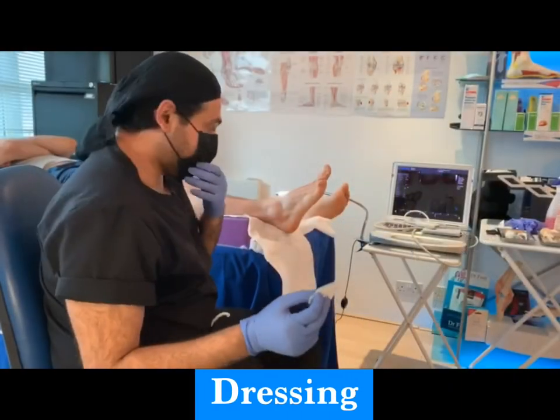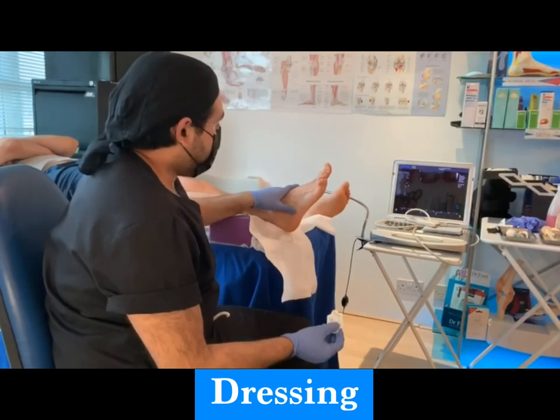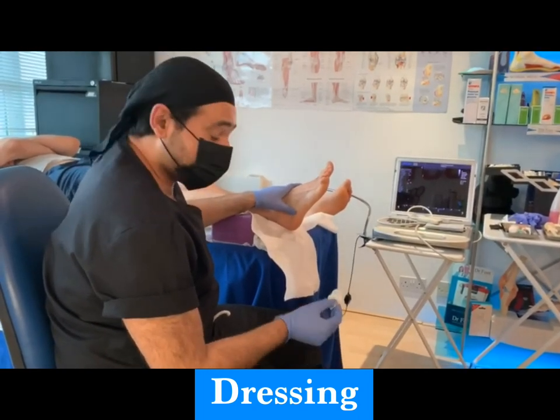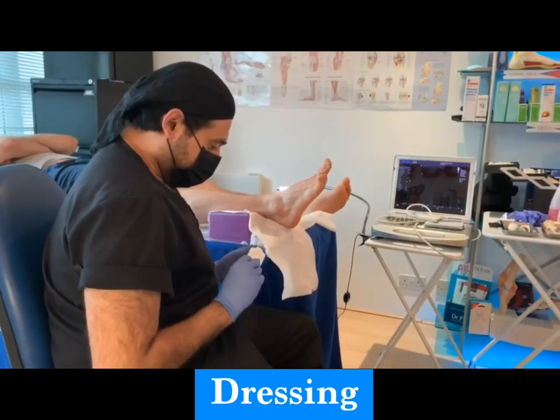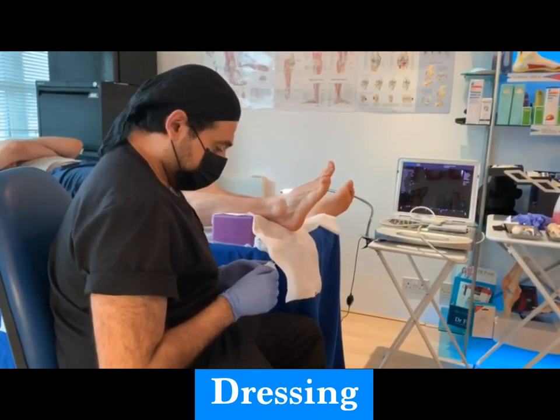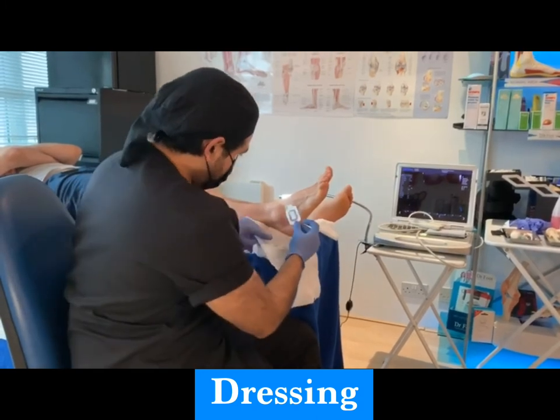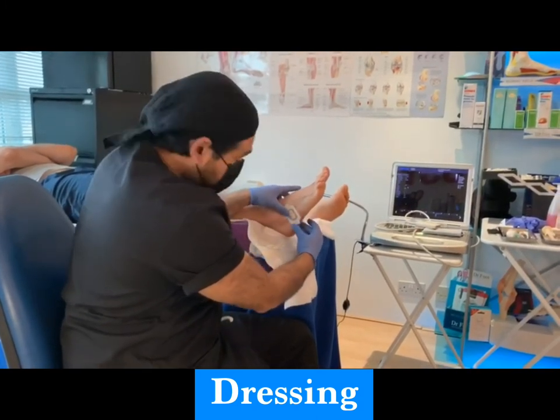So the injection's all done — it went really well. I'm anticipating this patient's going to get back to doing what he wants. We're going to put a dressing on it and keep an eye on him. I'm anticipating he'll be fine.